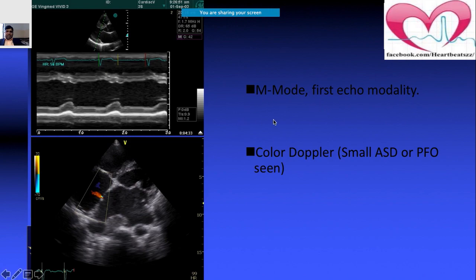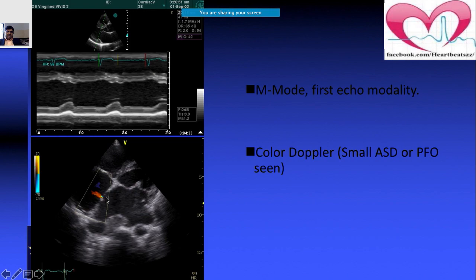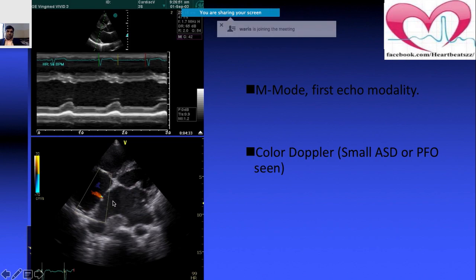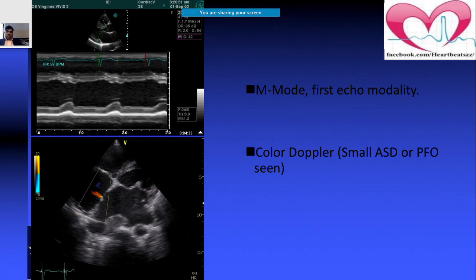This is M-mode imaging — you are seeing a cross-sectional view of the heart along the line you have placed. In this example, a patient shows slight discontinuation, so color Doppler is added to that segment.